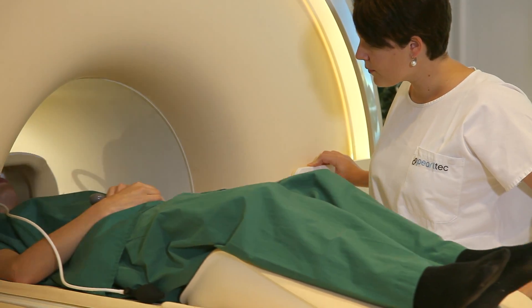Now you're ready to begin the examination. The PearlTech technology is designed to increase workflow efficiency and to reduce the amount of patient movement, leading to better image quality.